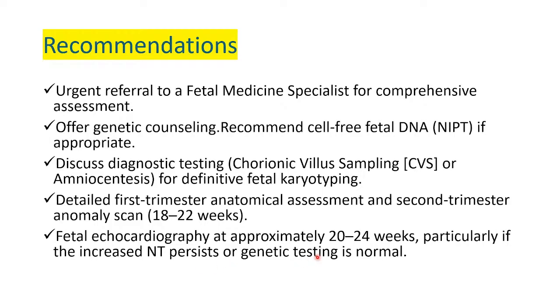So, ladies and gentlemen, the first trimester scan is very, very critical for dating the pregnancy and also for aneuploidy screening. We also do the pre-eclampsia screening in the first trimester. So be very careful to get a profile view so that you can assess the NT and also the nasal bone, whether it's absent or present.